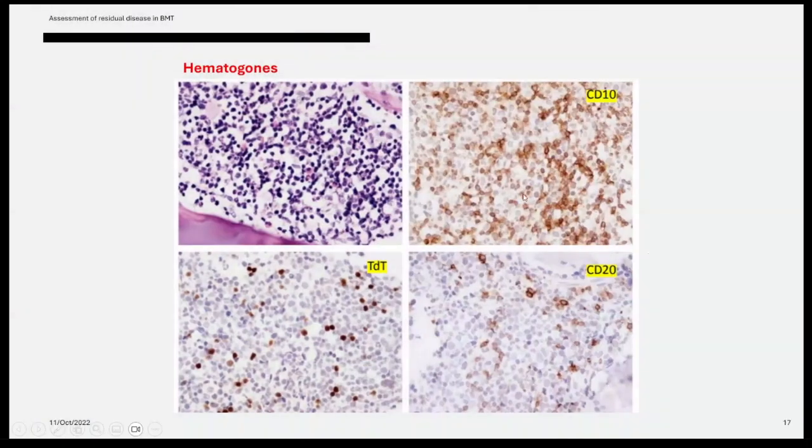Okay, this is the pattern. You have many immature cells, but they are slightly different from erythroid colonies because they are dispersed, whereas erythroid tend to be in a colony. Here they are dispersed small cells. The nuclear features are insufficient to call them blasts per se because they are quite small and mildly pleomorphic.